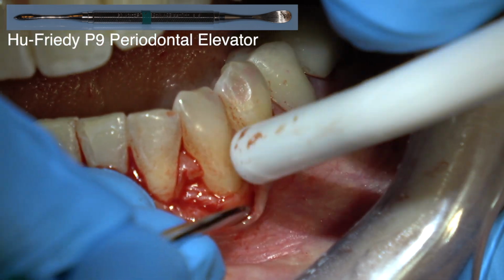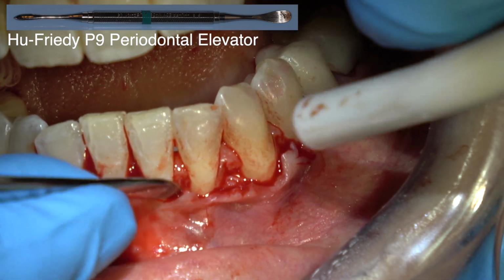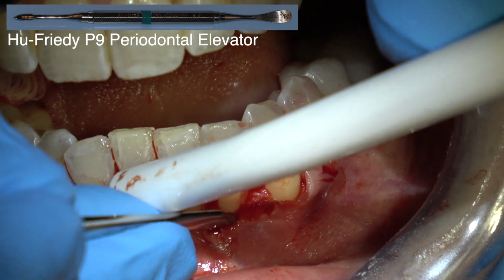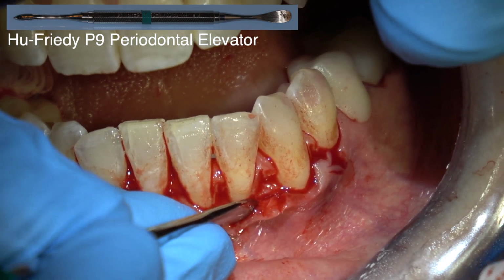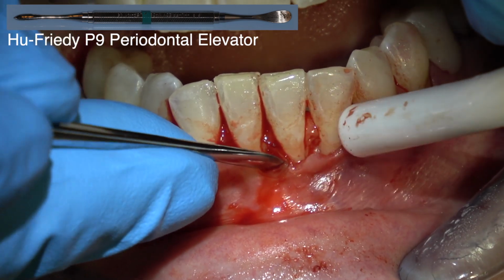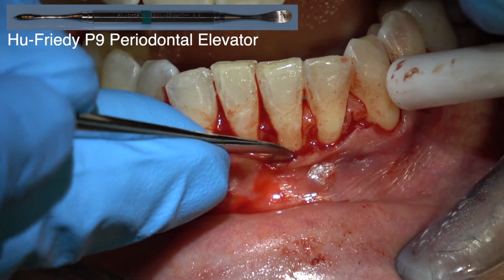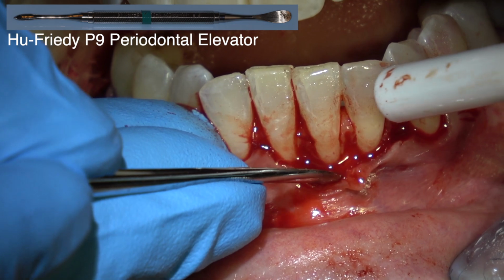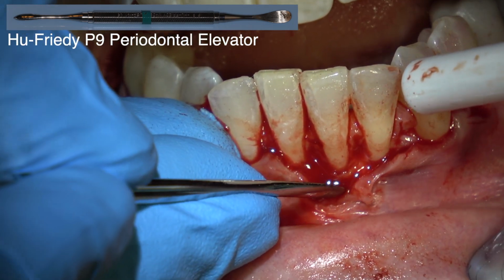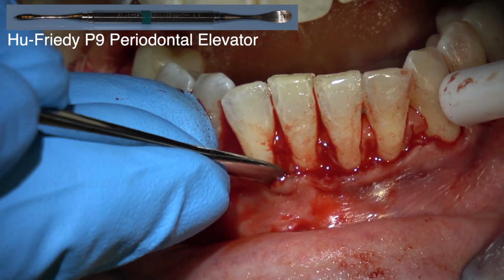See, it's too thin for a split thickness flap. So just very carefully reflect the flap. You don't want to perforate the flap if you can help it. That compromises the result. So what we're trying to do is just reflect the flap so we can place the periderm under the flap. So you don't want just a little barely reflected flap.